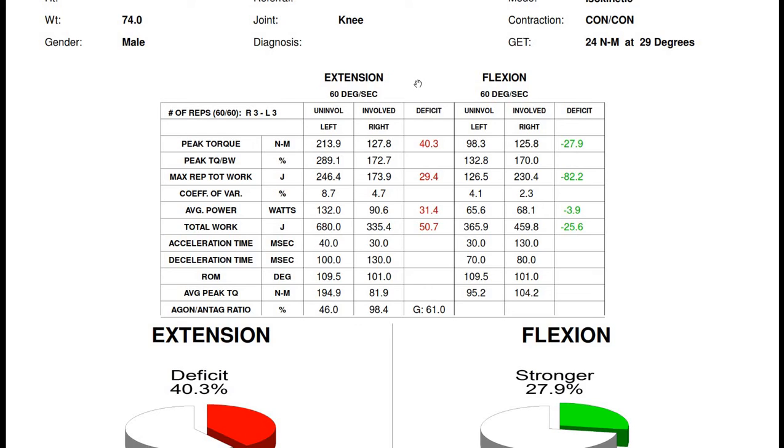And this could be for several reasons. This could be because it's taking longer to complete the repetition, therefore there's more discomfort, there's more pain. It could be because of greater demands placed on the muscle to complete the movement, which would be my bet. And from there we then have a reduced value.